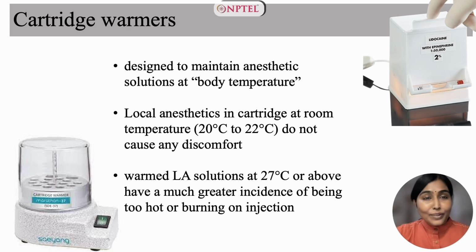Cartridge warmers are available in the market. They have been designed to maintain anesthetic solutions at body temperature. This is what their claim is. But these are not needed and cannot be recommended. Local anesthetics in cartridges maintained at room temperature do not cause the patient any discomfort on injection into tissues, nor do patients complain of the solution being too cold. In contrast, warmed local anesthetic solutions at 27 degrees centigrade or above have a much greater incidence of being described as too hot or burning on injection.